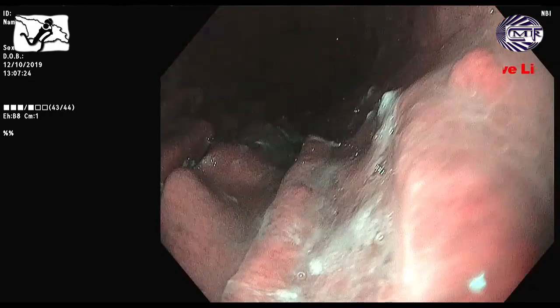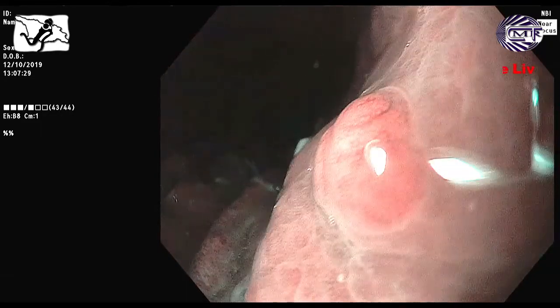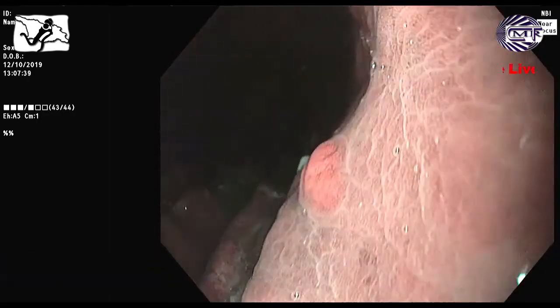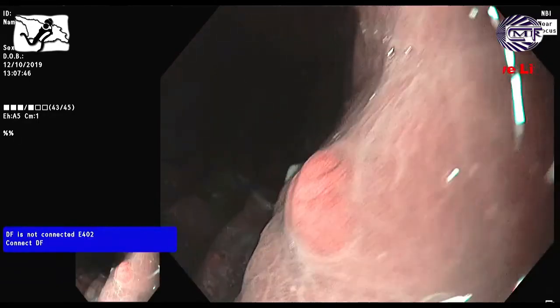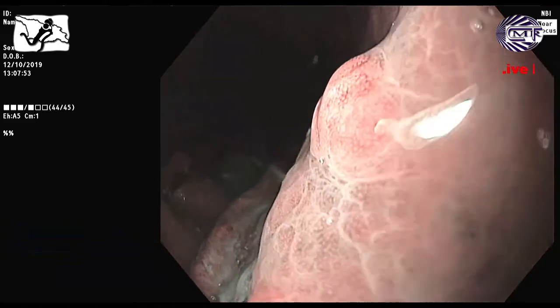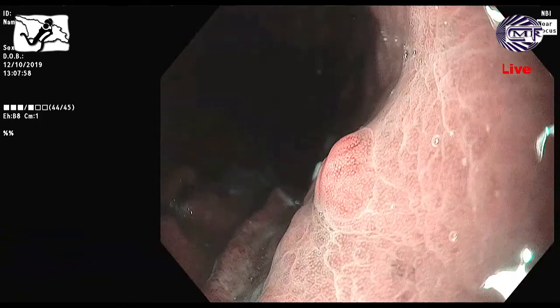Okay. To check this lesion, narrowband with the near focus. Okay, this is the narrowband image B8 mode. I changed to the other mode. Which is better? I think I prefer B8 mode because A5 mode has a little bit of blurring of the red color like that. Yeah. But look at this, relatively clean red image, right?